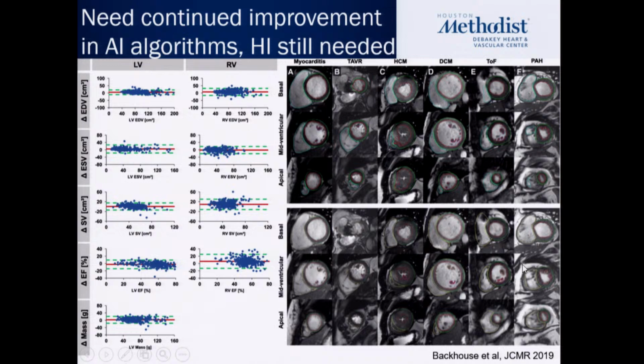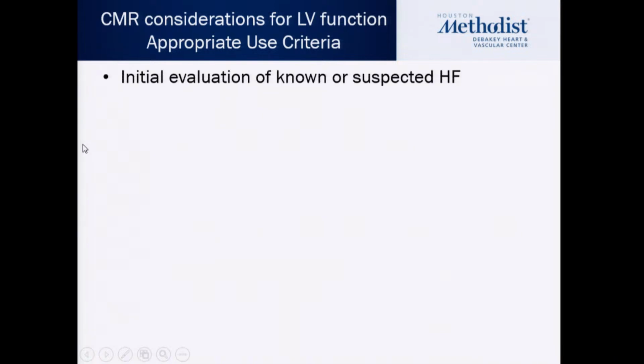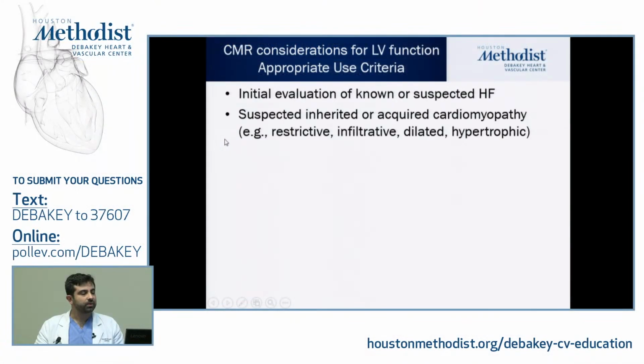And notice in this patient, let me find a good example. So in this patient with pulmonary arterial hypertension, notice towards the apex, notice how huge the RV still is with the prominent trabeculations, but notice how the software only traced this section of the RV. Similarly here, for example, in HCM cases, it kind of got lost here in the septum. And for those, you still need to make your adjustments, but this saves you a lot of time, similar to the AI acquisitions by the technologists.